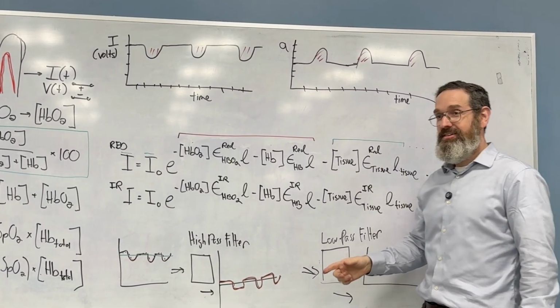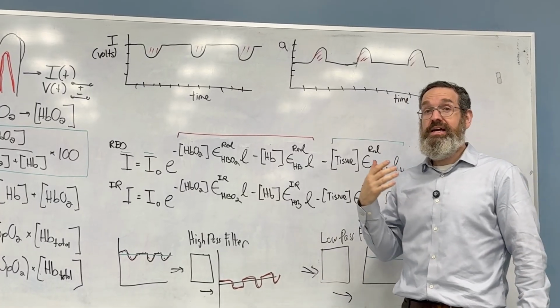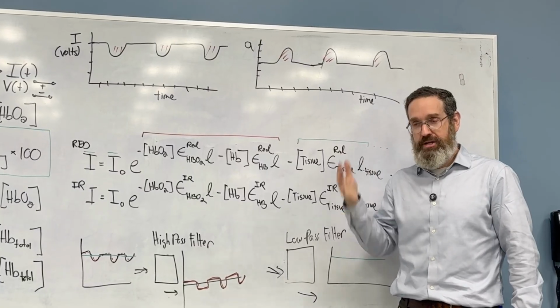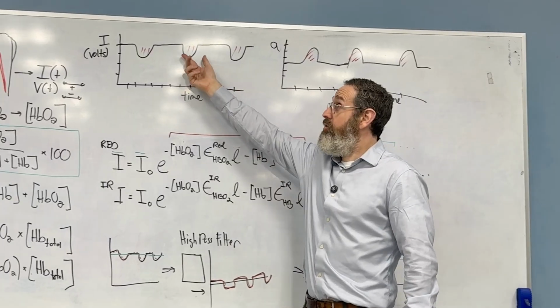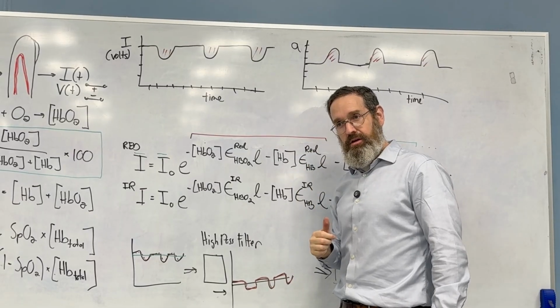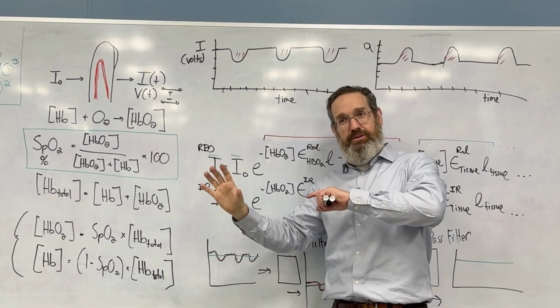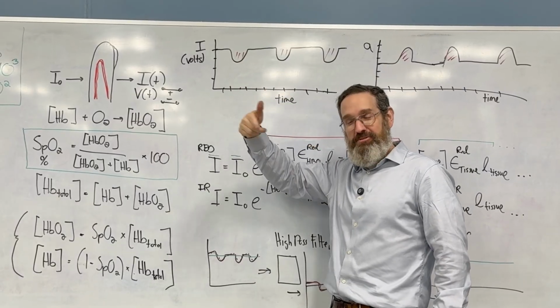And so you see, it's interesting, right? You learned about high-pass, low-pass filters, and we talked about EKG. But I said it's used for everything. It's used for every single biomedical measurement. Here you go, it's used here as well. You can take the part that you want and strip it out. That's the concept behind a pulse oximeter. And remember, it says pulse oximeter. So you do the pulse, you get that for free, and then you do the oximetry.